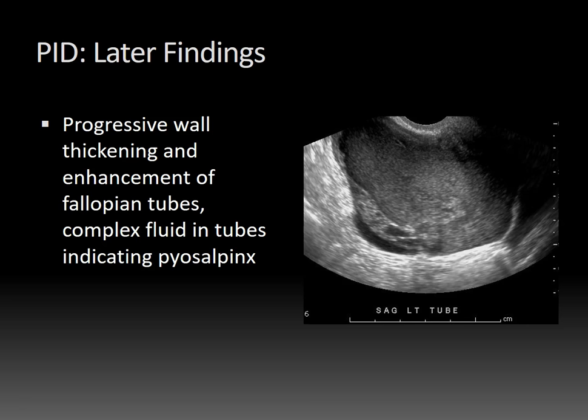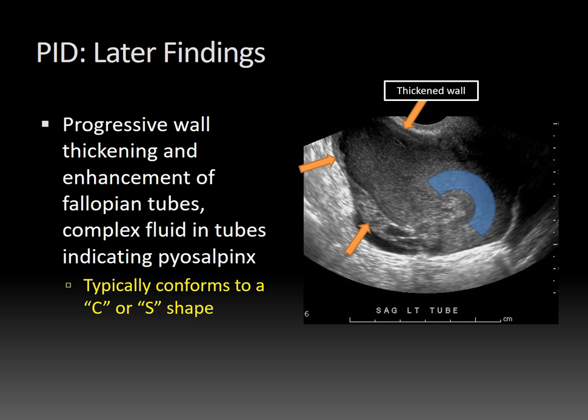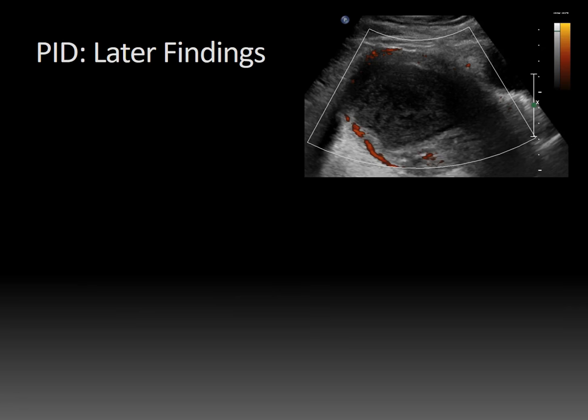With later findings of PID, you start getting progressive wall thickening and enhancement of the fallopian tubes, and complex fluid and debris accumulate in the tubes, leading to pyosalpinx. That dilated tube will still typically conform to a C or an S shape — and that's a key finding. So here you can see on ultrasound there is thickening of the tubal wall and debris in the tube, but you still see this C shape.